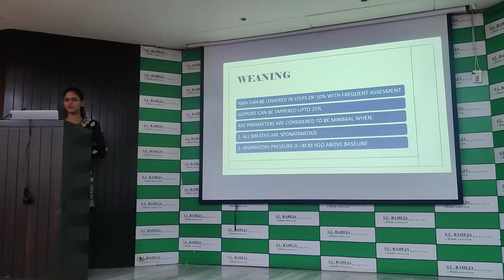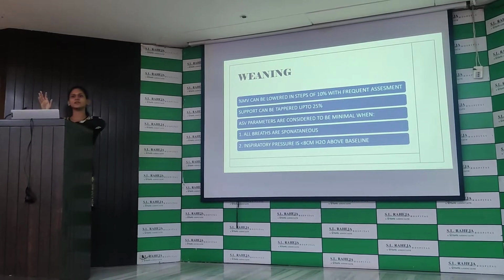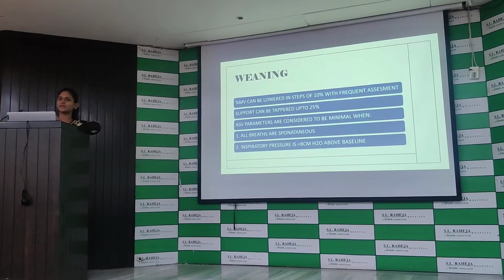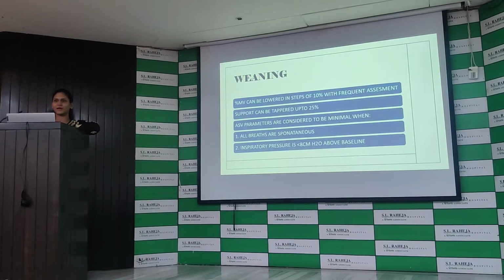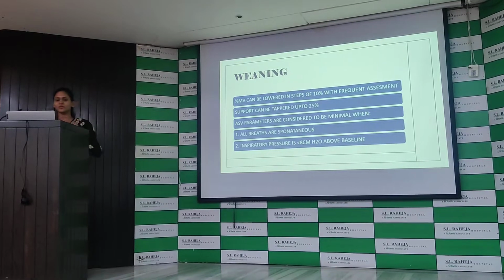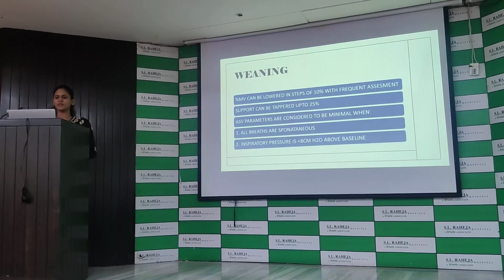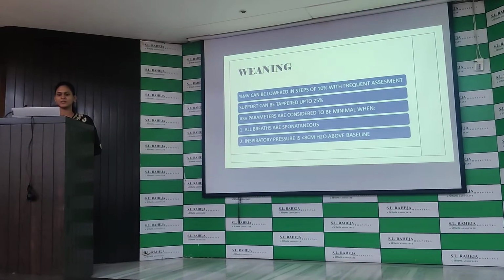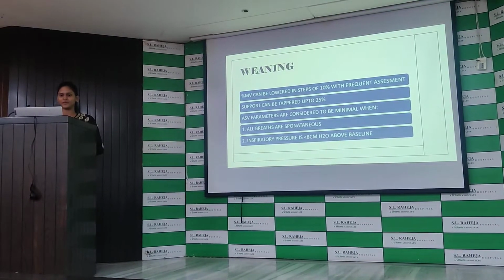Then weaning. We can use this ventilation from start to end, whether the patient is spontaneously breathing or paralyzed, we can use it till the weaning. So the minute ventilation now we have to lower in steps of 10% with frequent assessment, and the support can be tapered up to 25%.